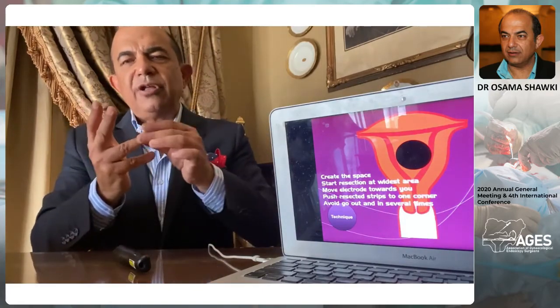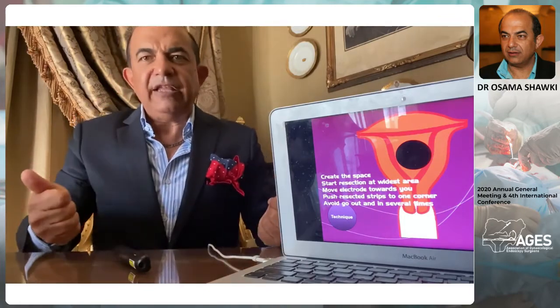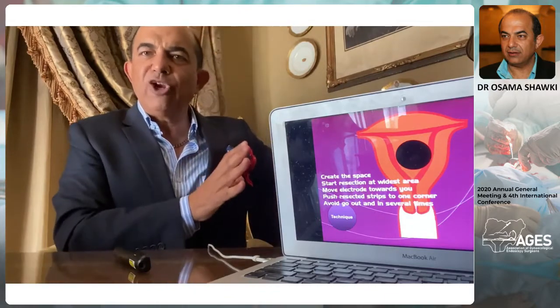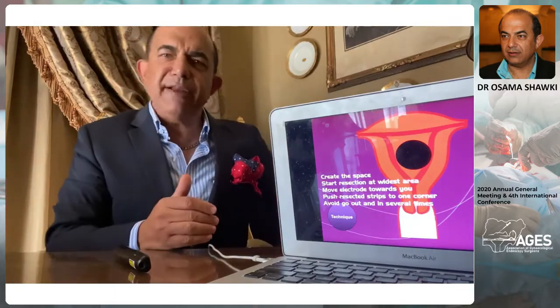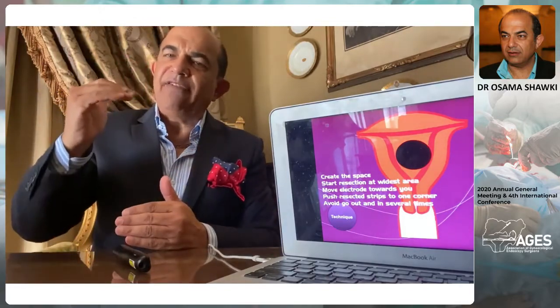So the duration, the volume, and lastly is the pressure. Definitely, if you're working with a high pressure for long duration, you're consuming volume of fluid, which leads to death. If you are working with a very low pressure for a long duration and many bottles of fluid, the patient will die as well. In my humble opinion, you have to reach a certain level of expertise.